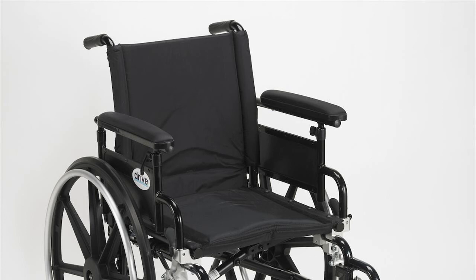Today I'm going to talk about how to remove the front rigging on a wheelchair. Transporting a wheelchair is less difficult when you remove the front rigging from the chair. The front rigging consists of the foot and leg rests on each side of the chair. The rigging fits over pins on the front frame of the chair. Removing the front rigging is a simple process that makes the wheelchair less cumbersome to transport.